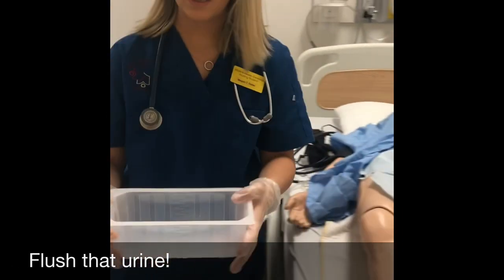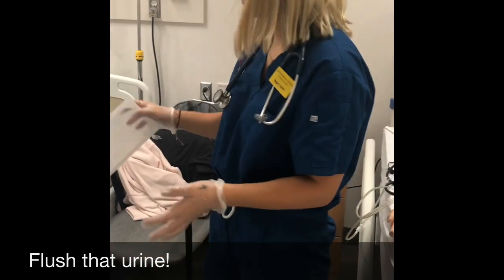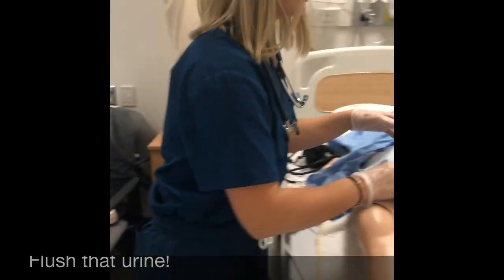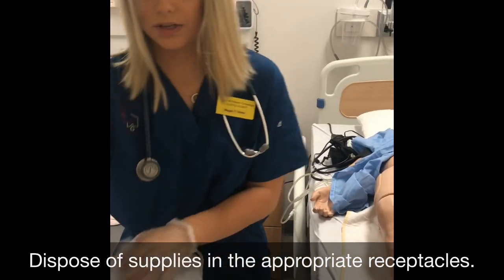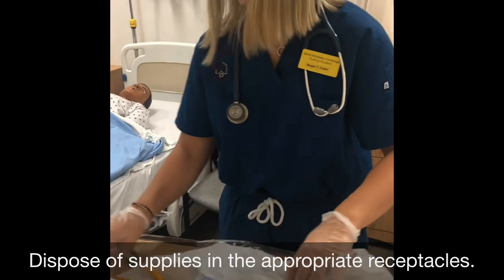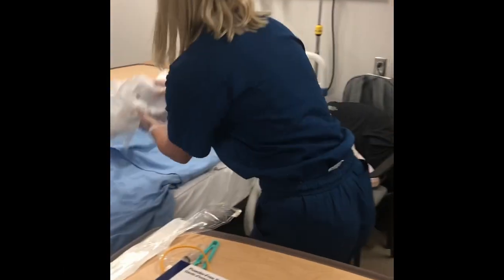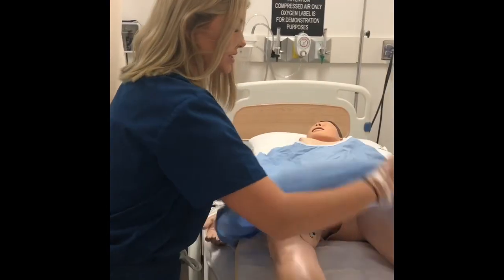Okay, so after I measure the voided urine, I would take this to the restroom, dump it in the toilet, and then flush. Also just going to clean up Mr. Mancini. And I'm going to dispose of all of this properly into the correct bin. So pretend I threw that away. I'm going to cover up Mr. Mancini.